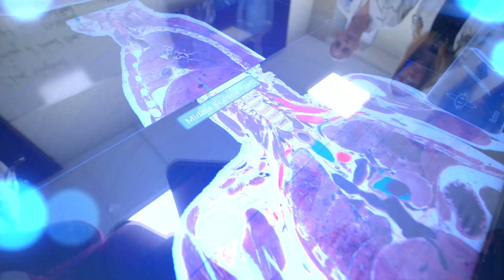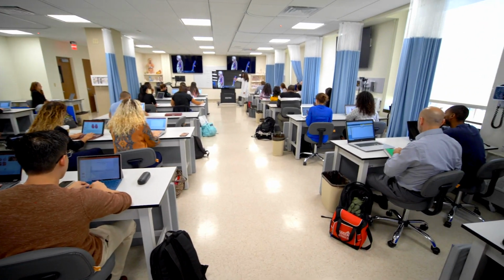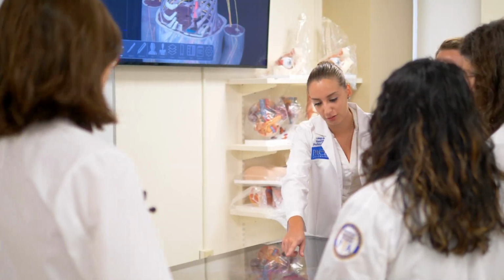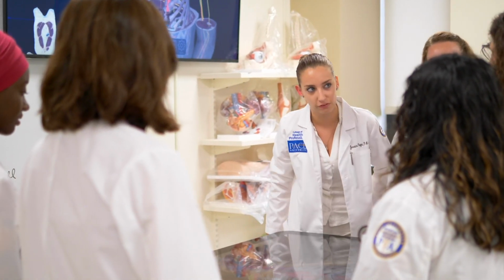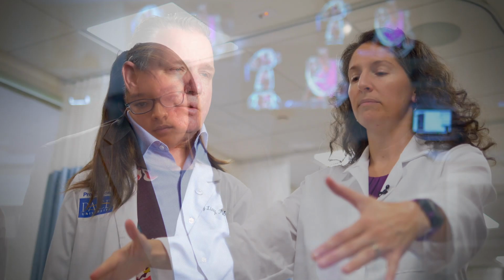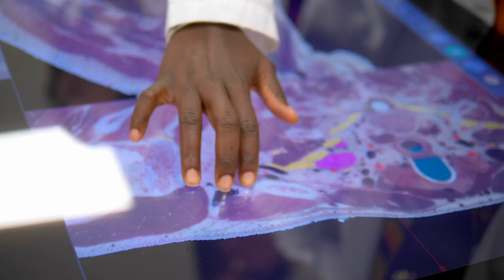Many programs utilize cadavers as part of the core of their anatomy experience. We started to investigate alternative methods for delivering the same kind of content. We found that this can be done equally as well with simulation. Sectra visualization table includes a number of different elements that are provided to enhance or to be an adjunct to cadaver dissection. Part of our offering is the VH dissector.